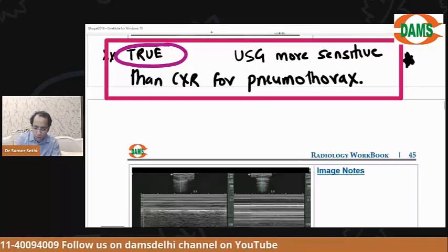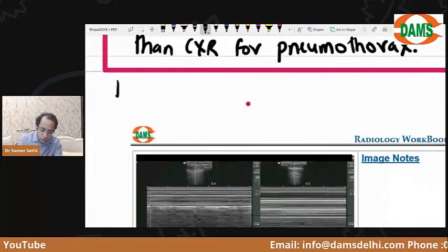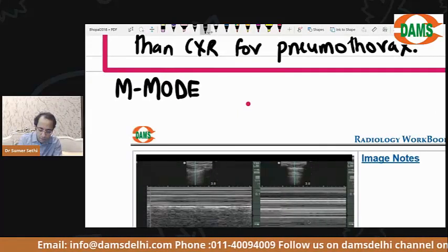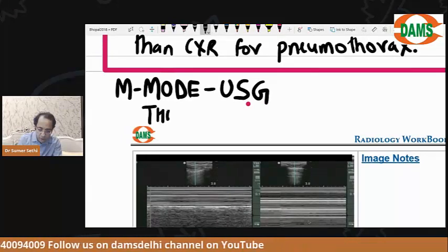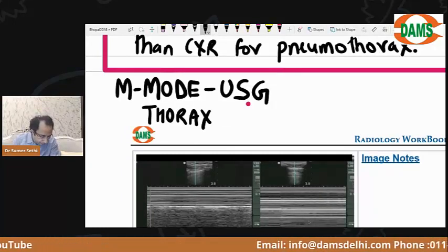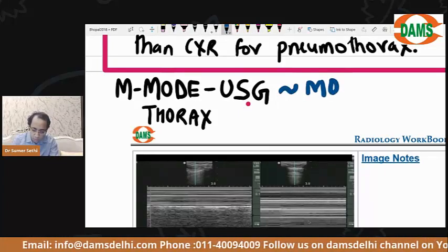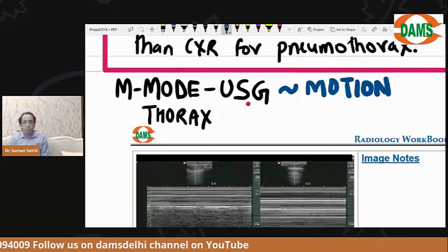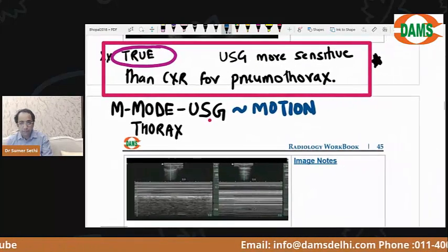Okay, listen to me now. In ultrasound, in thorax, we use a mode called M mode ultrasound. In extended FAST, in thorax, we use a mode called M mode ultrasound. M mode is sensitive to detect movement. M mode is going to show you the movement. Okay, it's going to show you the motion. Now listen to me and answer.